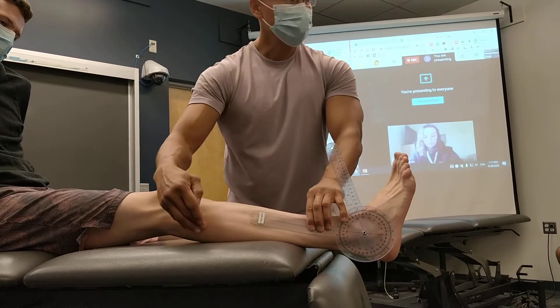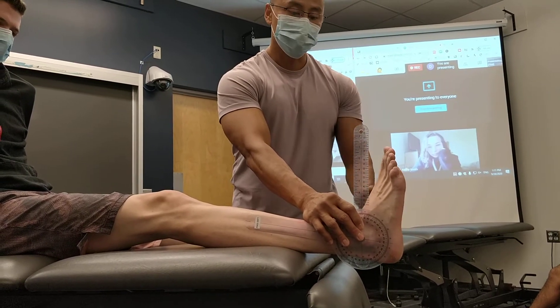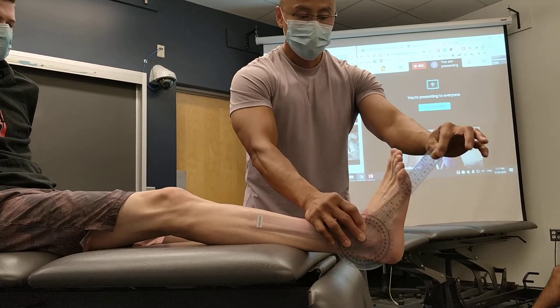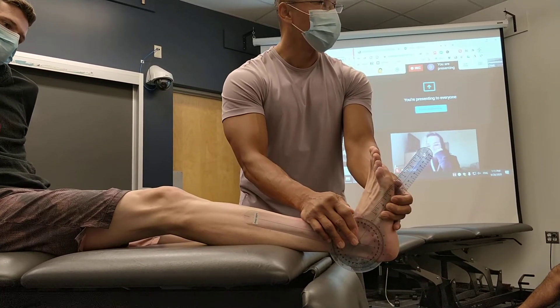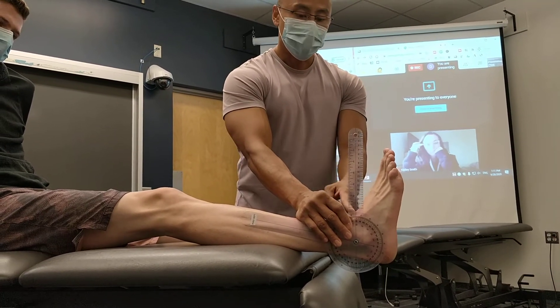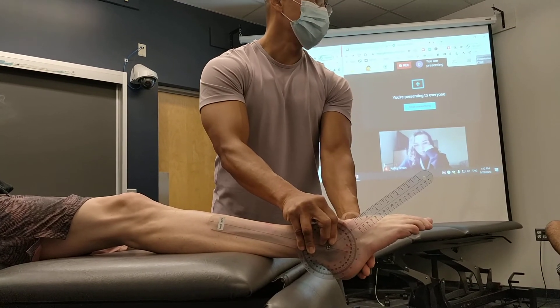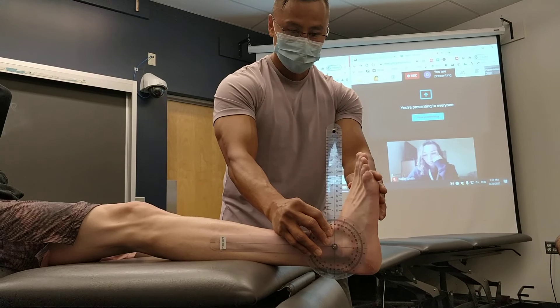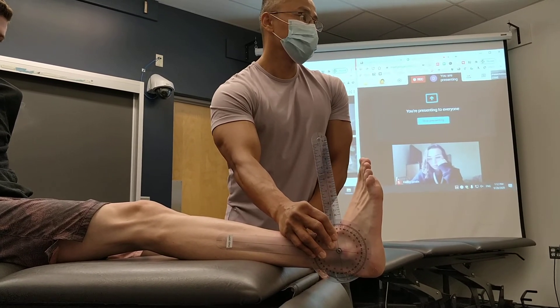Okay, so to recap. Parallel with the lower leg — fulcrum or axis — parallel with the surface of the foot, the plantar surface. Your choice: you can either use base of the fifth or plantar surface. If you use the base of the fifth, keep it at 90. Adjust until it's lined up — that is your new zero. Then do plantarflexion or dorsiflexion from that point. Option two: perpendicular and parallel. Eyeball the parallel surface — that is your zero. Plantarflex, keep it parallel with the surface you used at the beginning. That is your plantarflexion range. Dorsiflexion again — parallel with the plantar surface. So that's zero. He's going to dorsiflex; I'm going to dorsiflex this as well to make sure it's parallel with the surface. And that's my dorsiflexion angle.